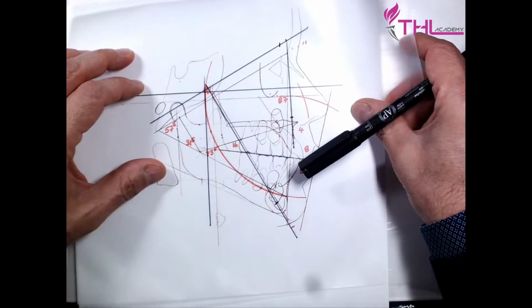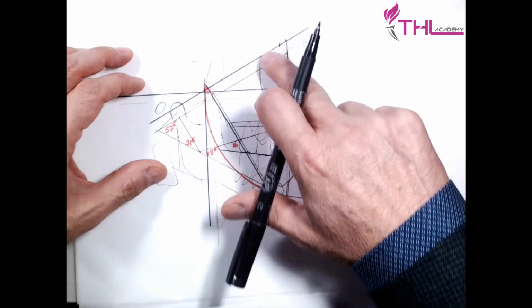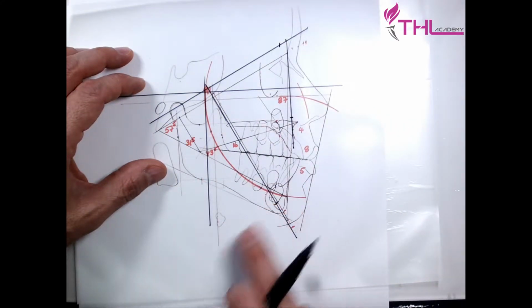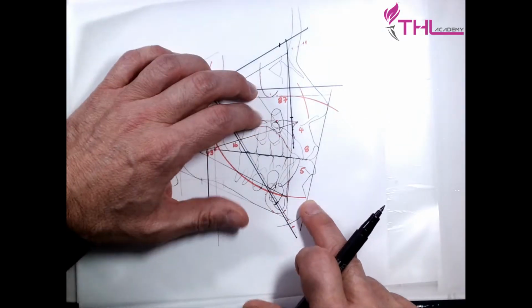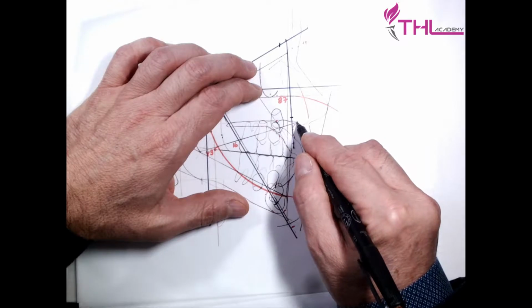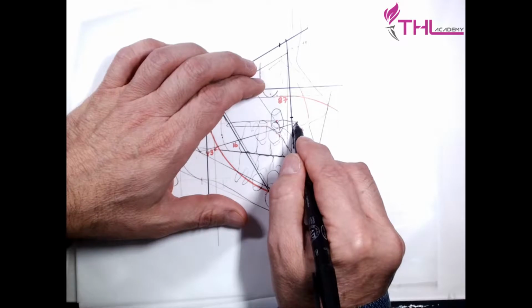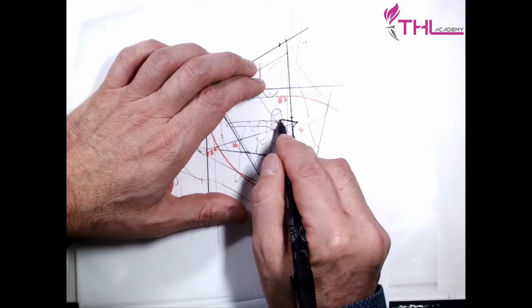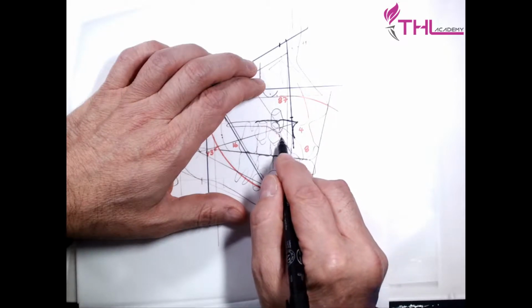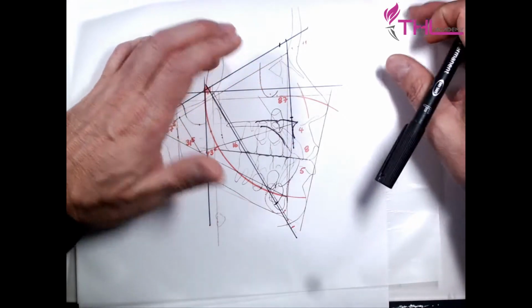When you do this, you have to check that you have parallel the basion, parallel the PTV, parallel the facial axis. When we push this, this must be parallel to this. Here I draw the anterior part of the maxilla.